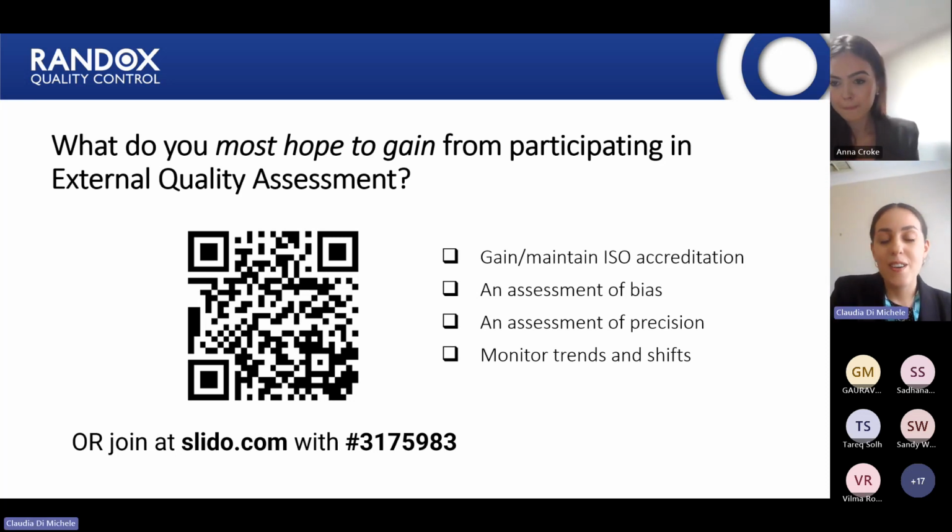All right, thanks to those who participated. If you participated, you can see your anonymous answers on the screen now, but I'll just share with you some of the answers we received. We had most people saying they hope to gain an assessment of bias, and definitely this is one of the main purposes of EQA and what we're really going to be talking about today.